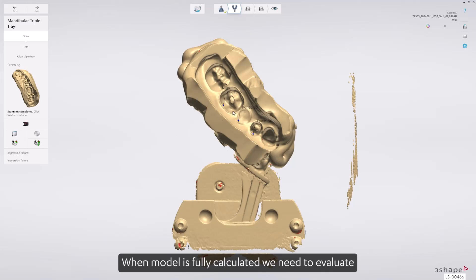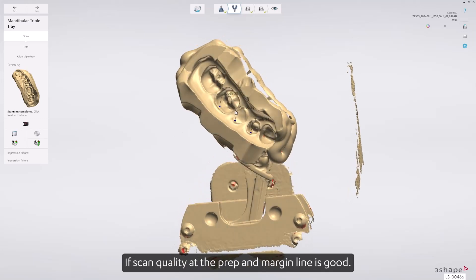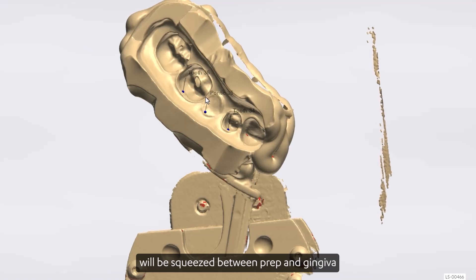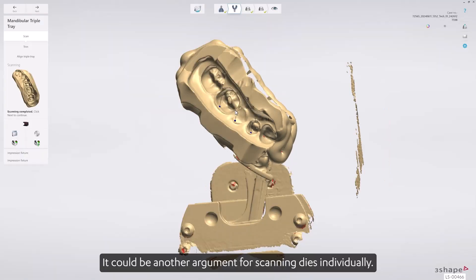When the model is fully calculated, we need to evaluate if the scan quality at the prep and margin line is good. It is expected that very thin layers of impression material will be squeezed between the prep and gingiva, and those might not be possible to post-process ideally. This could be another argument for scanning dies individually.